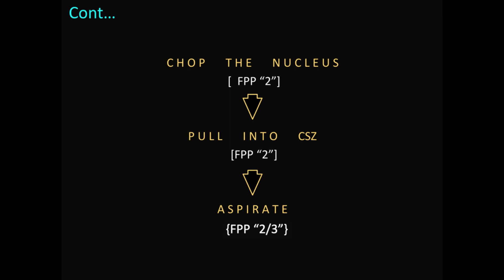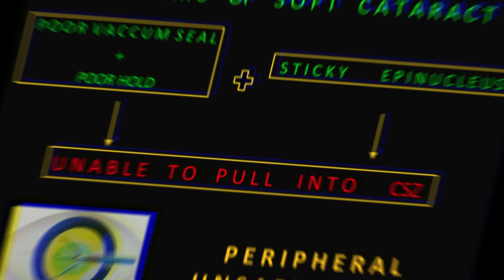Step four: with the foot pedal at position two, chop the nucleus. Step five: pull the chopped nucleus into the central safe zone with the pedal at position two. Step six: emulsify and aspirate in the central safe zone by switching the foot pedal between position two and three, using the energy as required. In this way, nuclear fragments are prolapsed from the capsular fornix and brought into the central safe zone.